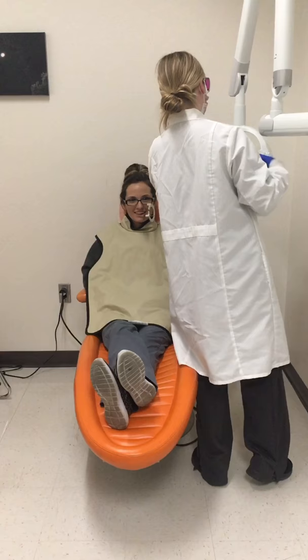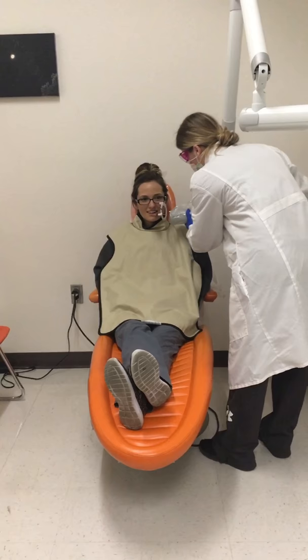So we're just making sure everything looks good. Then we'll take a couple PAs of those teeth that are bothering you.